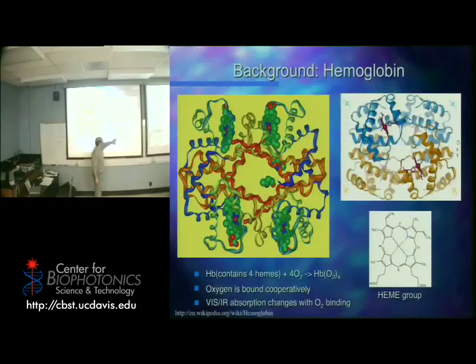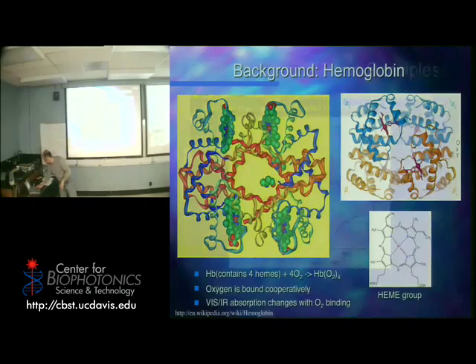This is only the heme group, only the central part in here, showing you what's happening there with the iron. But we like to make these kinds of diagrams because they help us visualize a three-dimensional structure. Now, this is the oxygenated form, and what you see, the oxygenated versus deoxygenated, it looks like this. This should be animating, but it's not animating right now. I'm sorry about that.